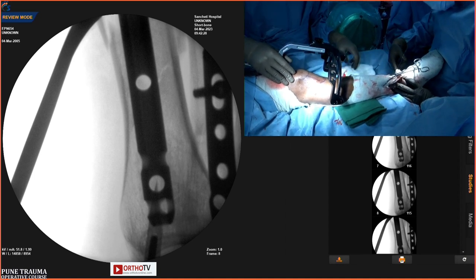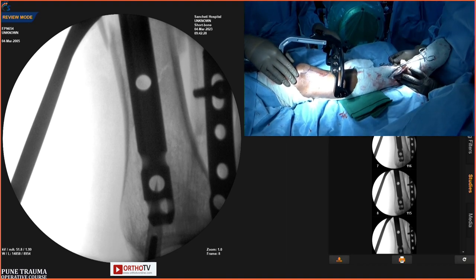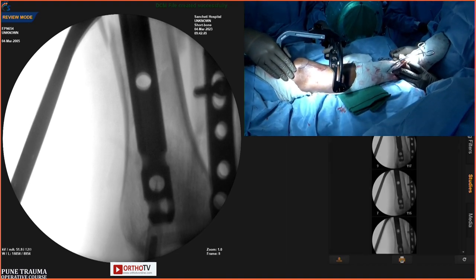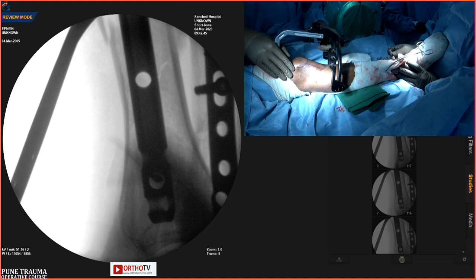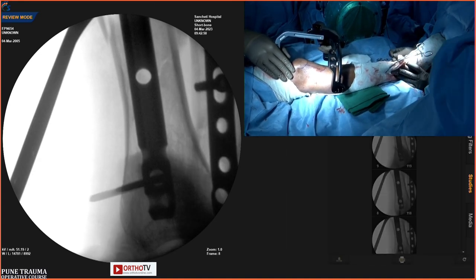Chetan, there is a question from the audience. To measure the length, are you happy with the nail length? He had inserted the guide wire, and he inserted one more guide wire up to the entry site. Both the guide wires are of the same length, and he measured through that. Sure, yes, that is how you do it.